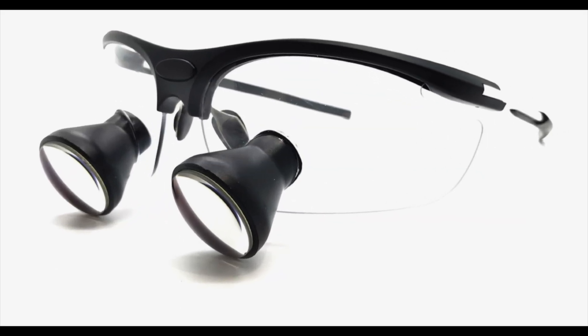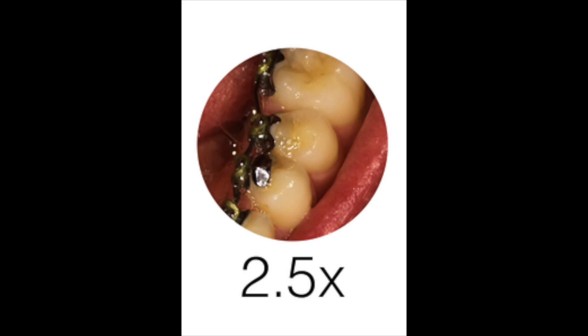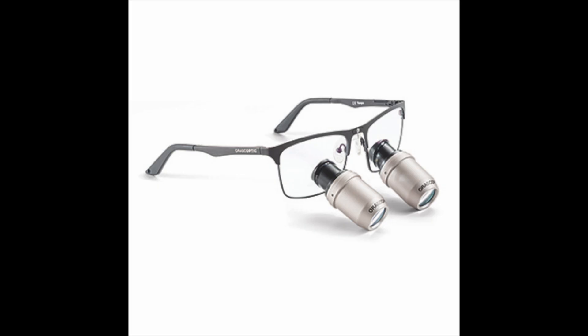With 2.5x magnification loops, you can see the telescope size is minimal. You will have a large field of view, so not only can you see the tooth you're preparing, but you will simultaneously see one or two adjacent teeth and tooth structures such as the surrounding gingiva at a single glance. Loops offer much more detail than the naked eye alone; however, this low magnification offers the least amount of detail.